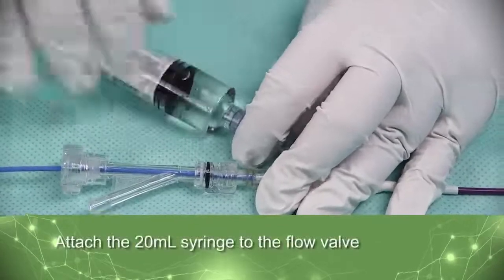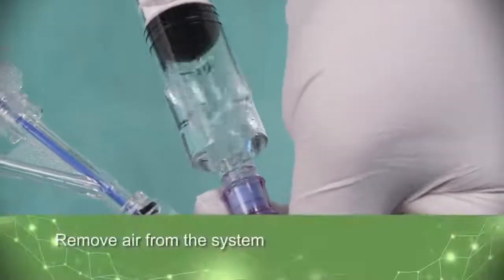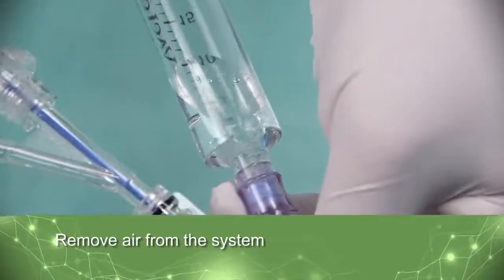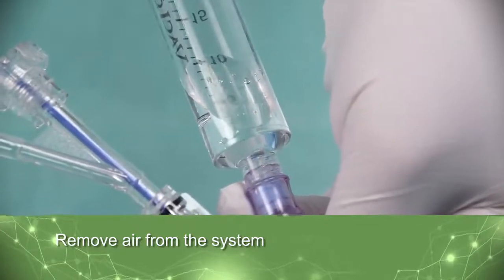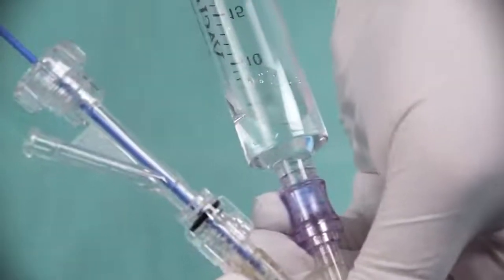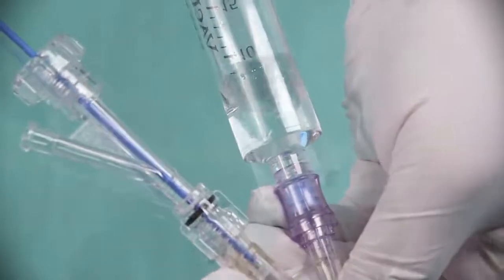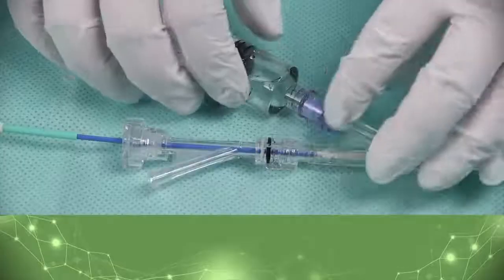Attach the 20-milliliter syringe to the flow valve. With the syringe pointed downward, pull back on the syringe plunger to aspirate the Balloon Inflation Lumen. Maintain pressure until the air bubbles stop forming in the syringe. Release the syringe plunger to allow media to be drawn into the balloon lumen. Repeat a second time to ensure air has been removed from the system.